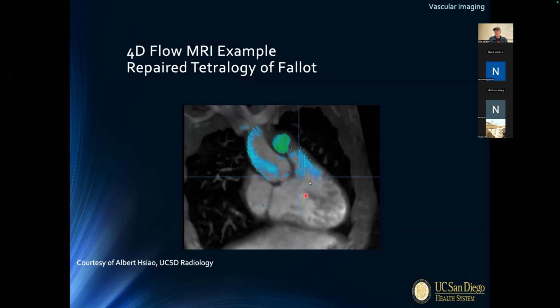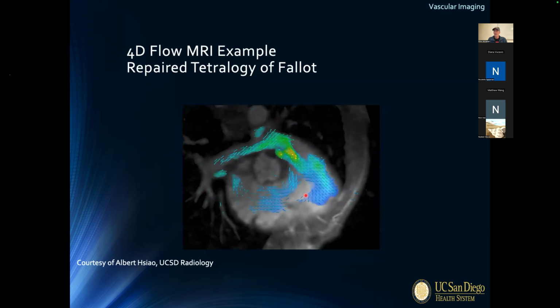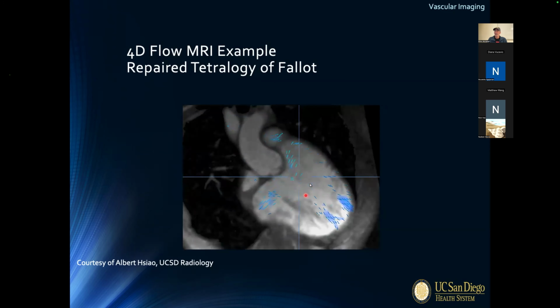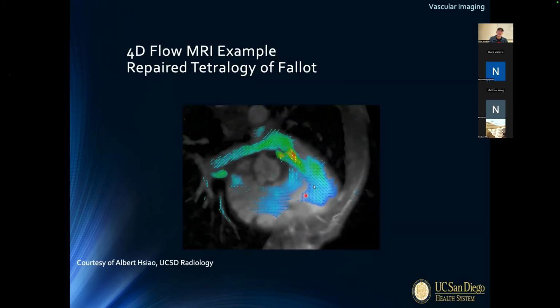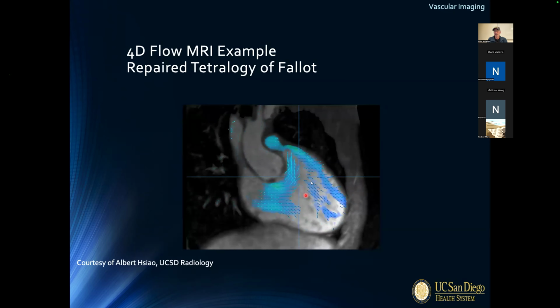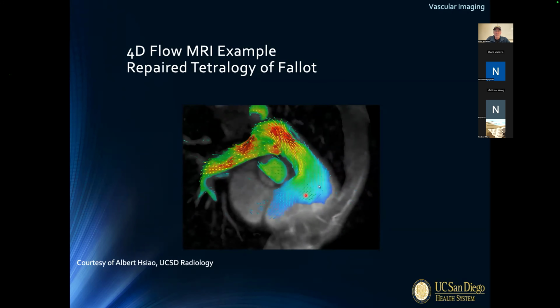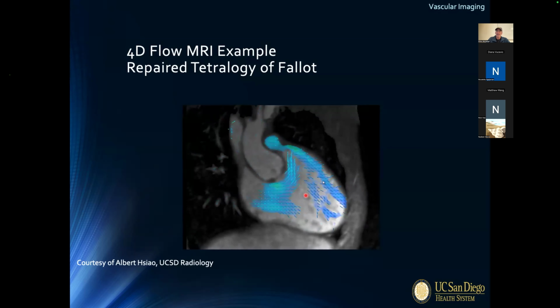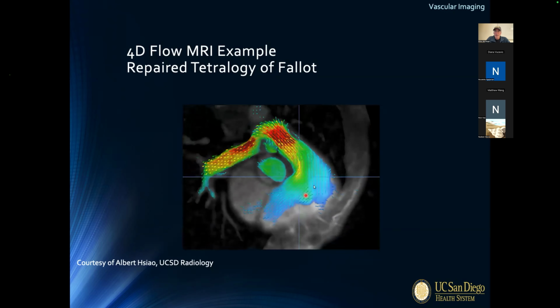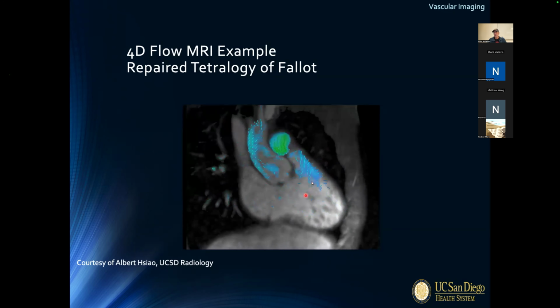And you can think of it this way. You do a baseline acquisition with no velocity encoding, and then you do 3 new acquisitions, one where the velocity is in X, one that's in Y, and one that's in Z. And you take the difference between each of those and the baseline, and that gives you essentially the difference in phase from the velocity encoding. That turns out not to be the most efficient way to do it, but it is a way to do it. And after that, you can then have this interactive volume in which you can see where the jets are and what direction all the blood is flowing, etc.